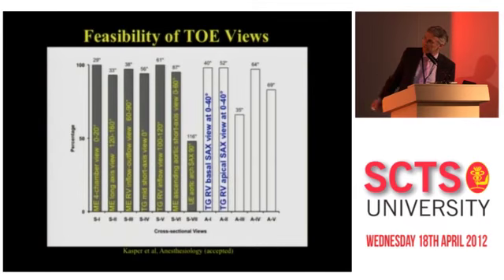These are the standard views, and here you see the 2 additional views that we're focusing on right now. What you can see is that these 2 additional views were obtained in nearly 100% of patients, similar to most of the standard views. And these numbers here are the seconds that we needed to obtain the view in good quality, and you see that was also quite similar to the standard views.